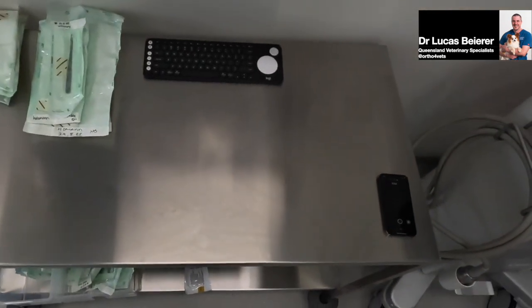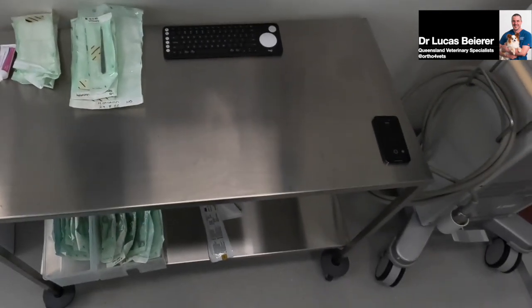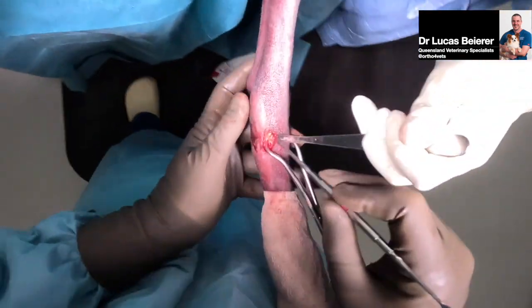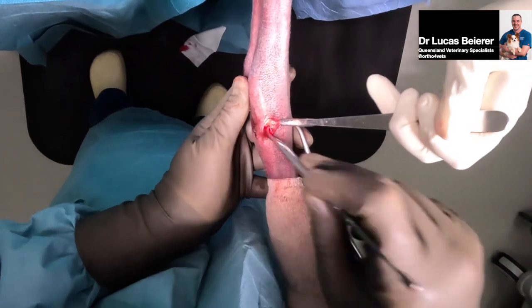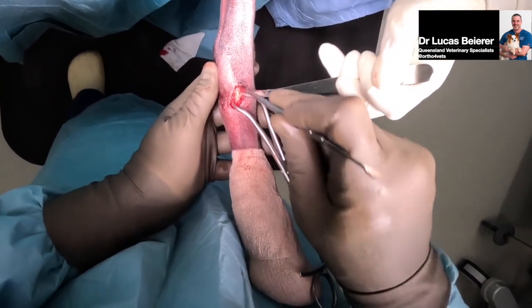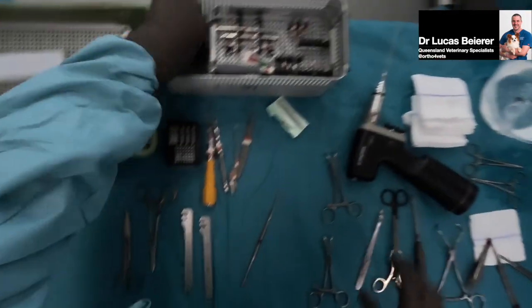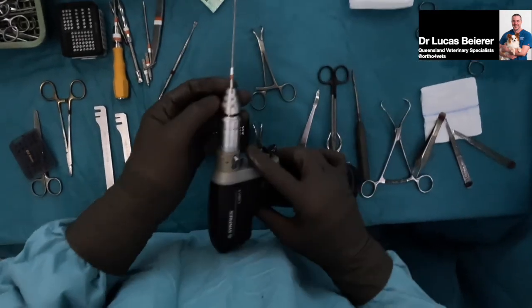Where do we want to place our implants, which position's most important? Probably ensuring that we're nice and distal on our medial to lateral screw is going to be key. So we'll put a little smaller screw dorsally on the cranial fragment. We'll probably just use a little 2.0 positional screw because I don't think there's a lot of bone to anchor it to.